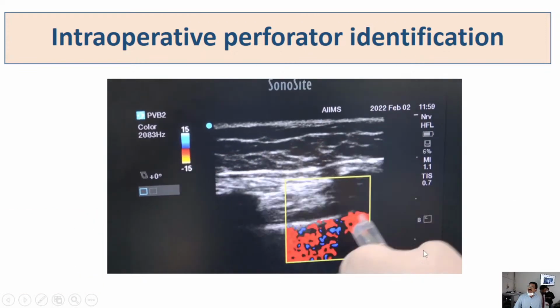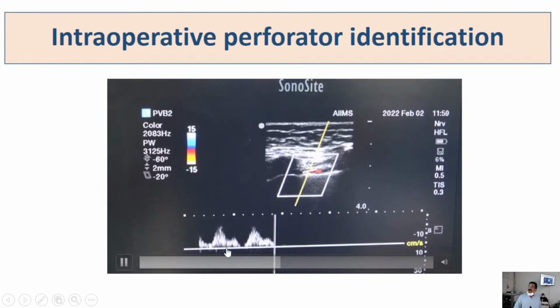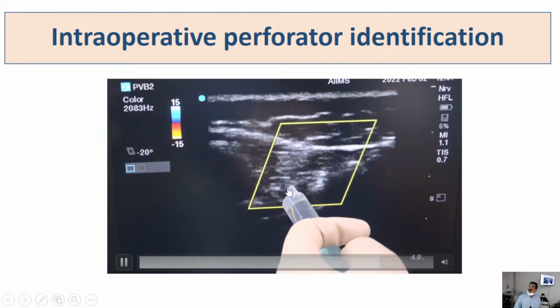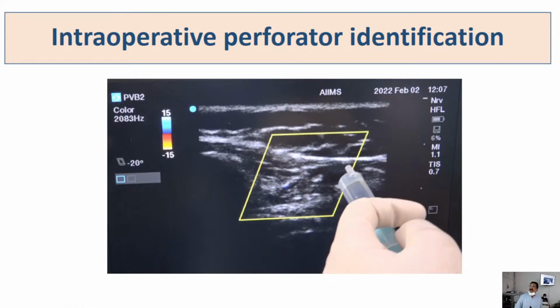Now, these are the ribs between which you first identify the artery in the internal mammary. Then you confirm it by Doppler. And then you see the perforator going into the flap. This is the perforator artery on which you base the flap. This is how the Doppler helps us while performing a perforator artery based flap.